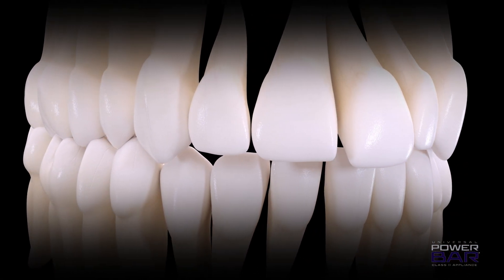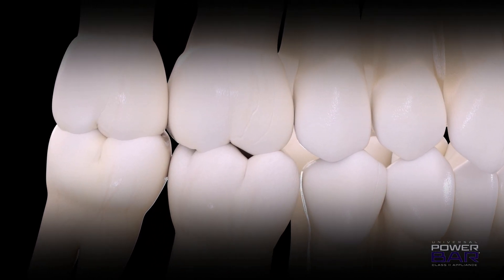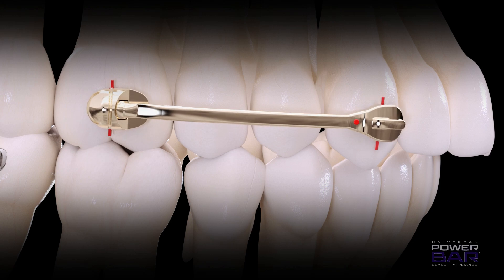The Power Bar was designed and engineered with the quality, convenience, and value you expect from American Orthodontics. Manufactured in American Orthodontics' state-of-the-art facility, doctors can count on the rigorous quality controls, providing a consistent product to produce consistent treatment results.